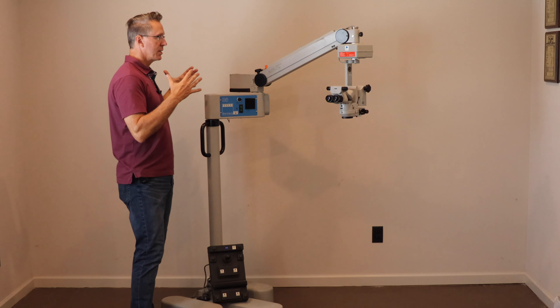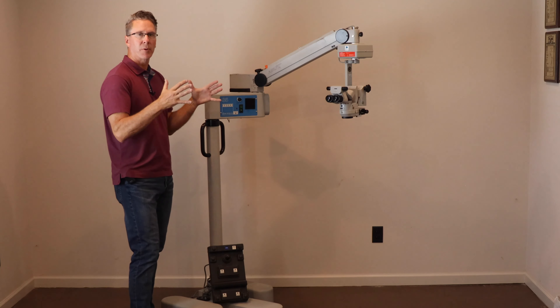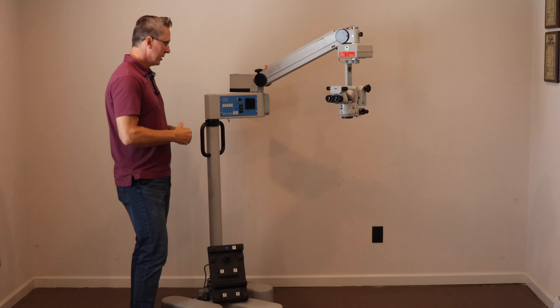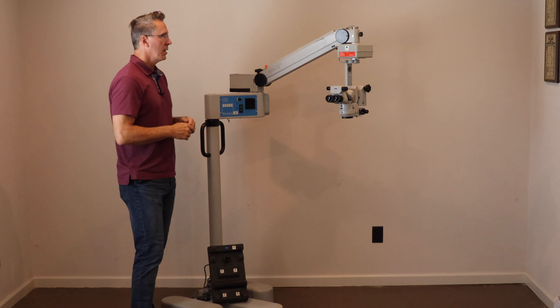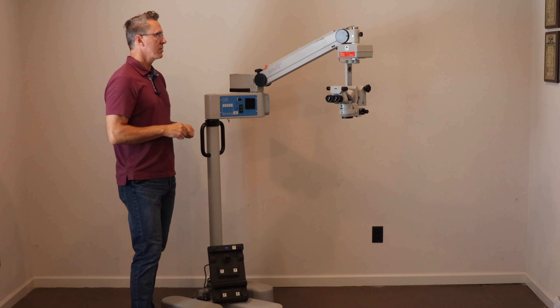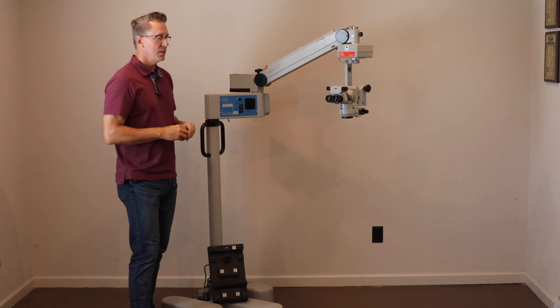In my opinion, it really has a wonderful floor stand for surgery centers where the operating rooms tend to be a little bit smaller. The base is not too large, the arm is not too long. It's a really, really good size and good moving floor stand for the surgery center.